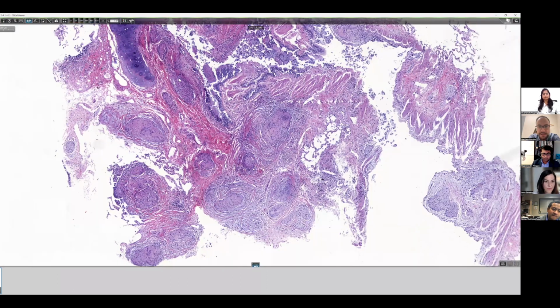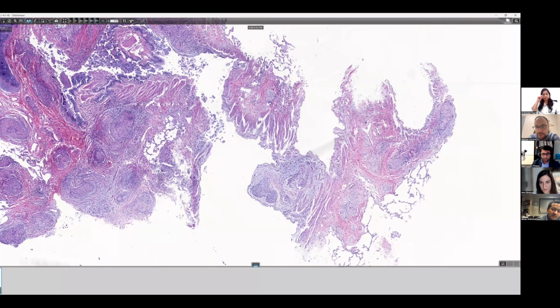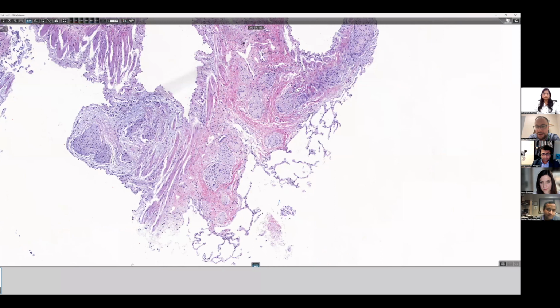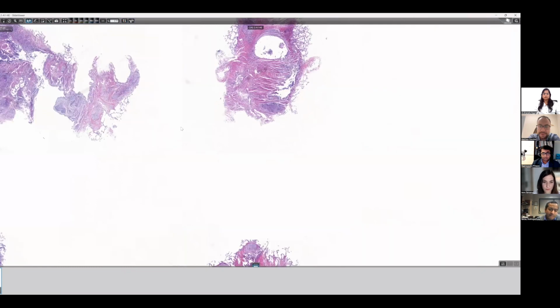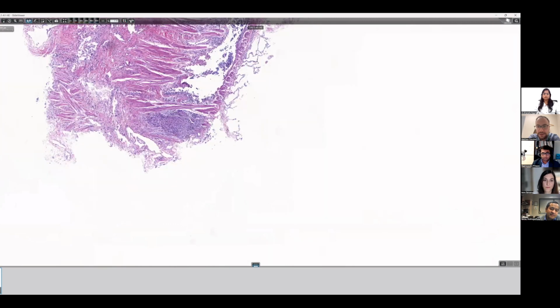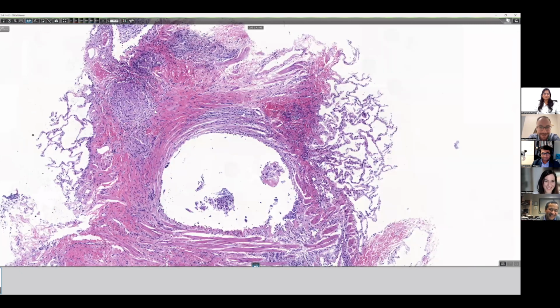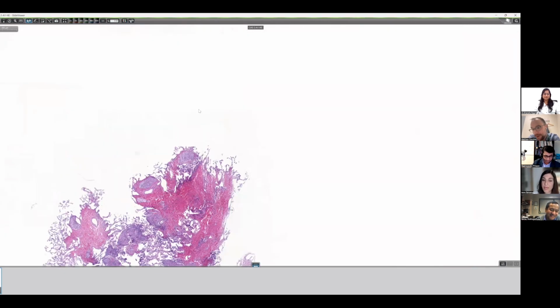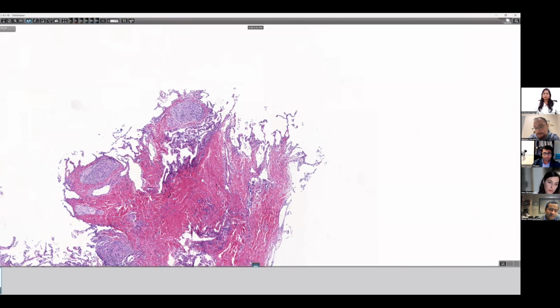The distribution is lymphangitic in a way. It's accentuated around these airways. I don't know if we have any pleura as well, but I'd want to correlate with the imaging and see if she has any hilar adenopathy. I worry that the history of antigen reactivity to those parakeets is actually a red herring, or a red parakeet, in a way, and that you're trying to trick us. Many people have antibodies against these antigens, and it doesn't mean that you have an illness.